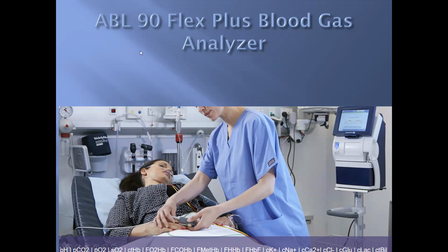So that's pretty good bang for your buck. Not only do you get your blood gas, you get an actual percentage of your hemoglobin and different hemoglobins and electrolytes. And what is the sample size? Like 2 mLs? How many mLs do you guys normally draw? 2? And on 2 mLs, you could run how many times?